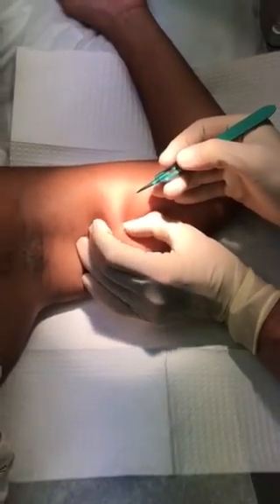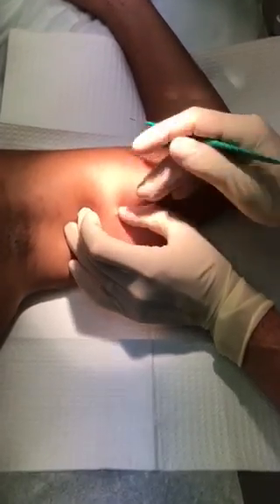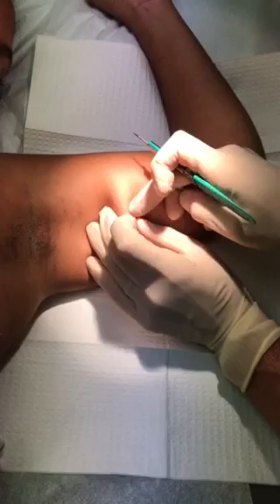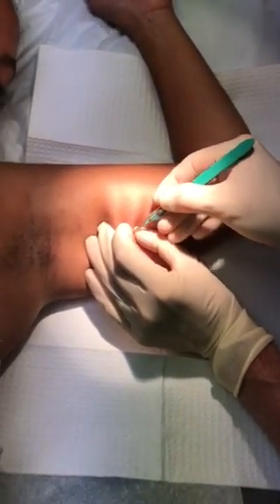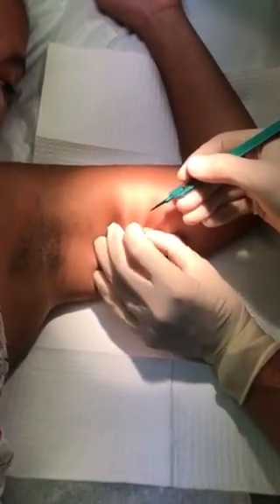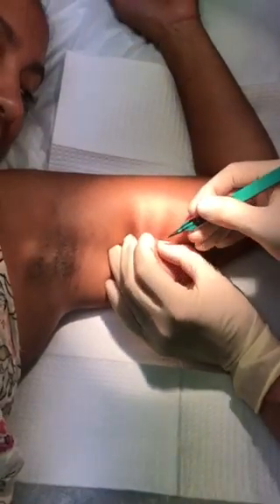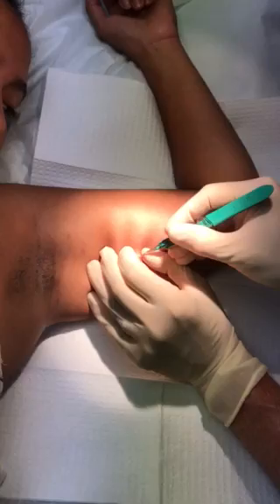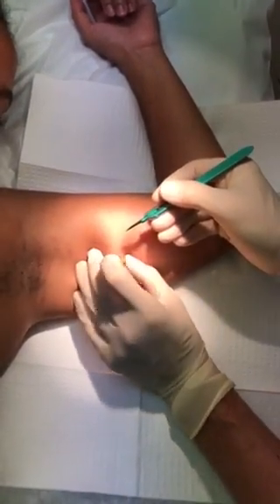Now you can just kind of work with it and it'll start working its way to the surface, and eventually you'll see the white tip just pop out. There's a capsule that forms around the Nexplanon that you need to open up. This method is a little slower, but you end up with a much smaller incision.